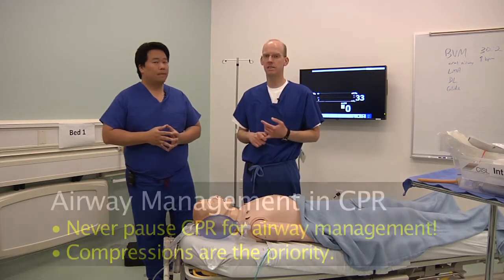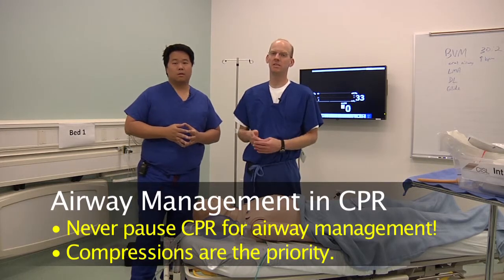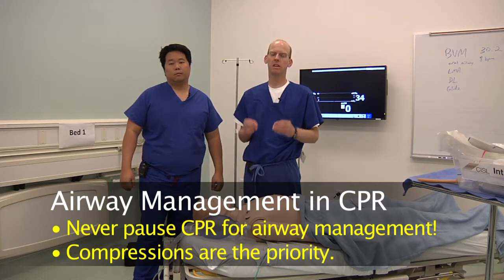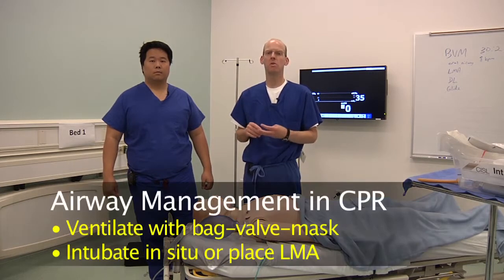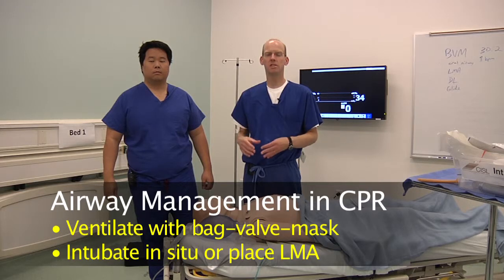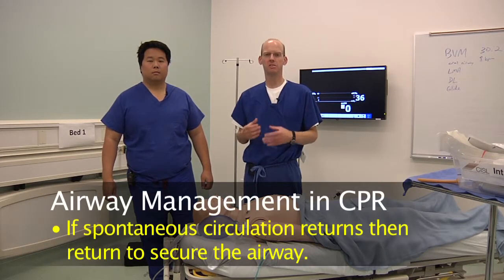It is not. This is a big difference from before. You should never interrupt compressions to secure an airway. Let me emphasize this strongly. Compressions are the priority. Airway management comes secondary. Either you achieve adequate ventilation with bag mask ventilation, or you attempt to intubate in the condition that you find the patient, or you place a laryngeal mask airway. If you get the patient back and you get a return of circulation, then you can secure the patient airway.